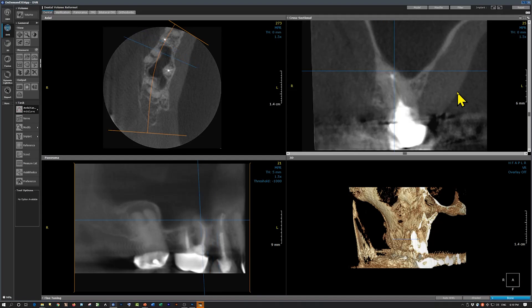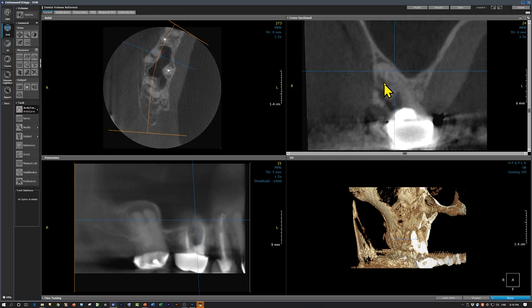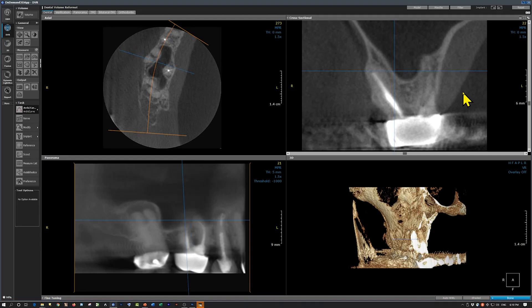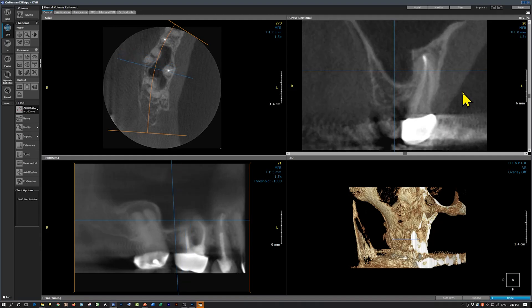We're coming to the mesiobuccal root of the first molar, and here is a radiolucency — so this would also be a residual apical periodontitis. The sinus floor appears intact and there is no thickening of the sinus mucosal lining.